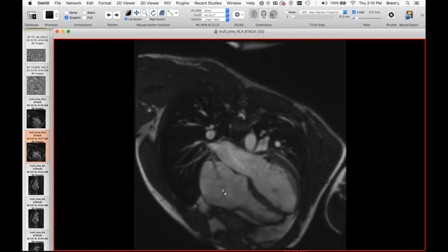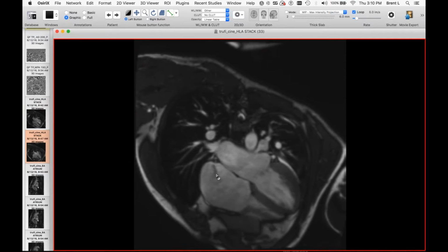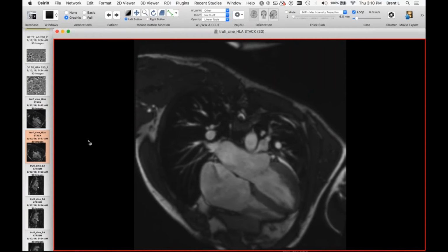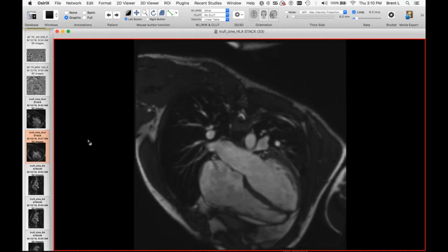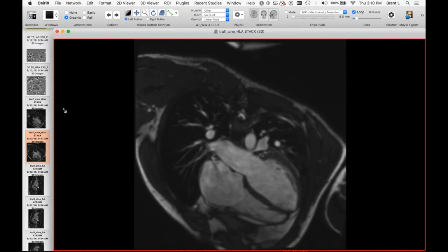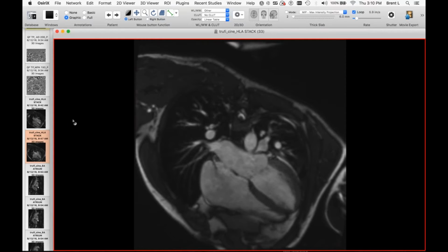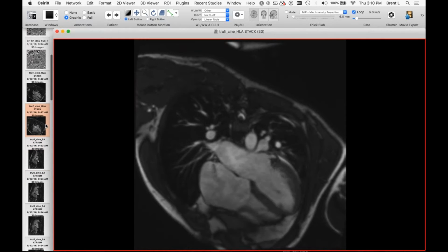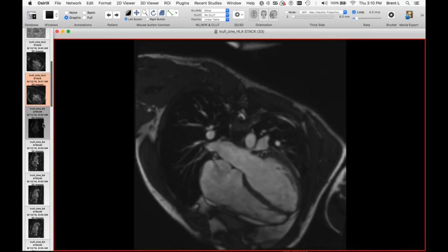In some of the views, we don't really see that well-defined filling defect at all. We see what looks like this linear jet. I'll tell you as well that we don't know that much about this patient, but referred from outside with shortness of breath, of course, and the indication was anomalous pulmonary vein. I don't have the outside echo, but I presume that an echo was done showing some abnormal flow close to the right atrial SVC junction, where an anomalous vein from the right upper lobe may drain.